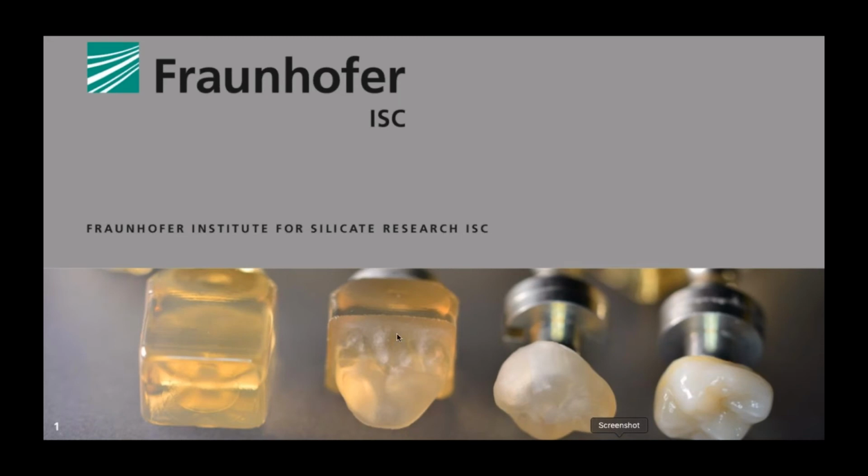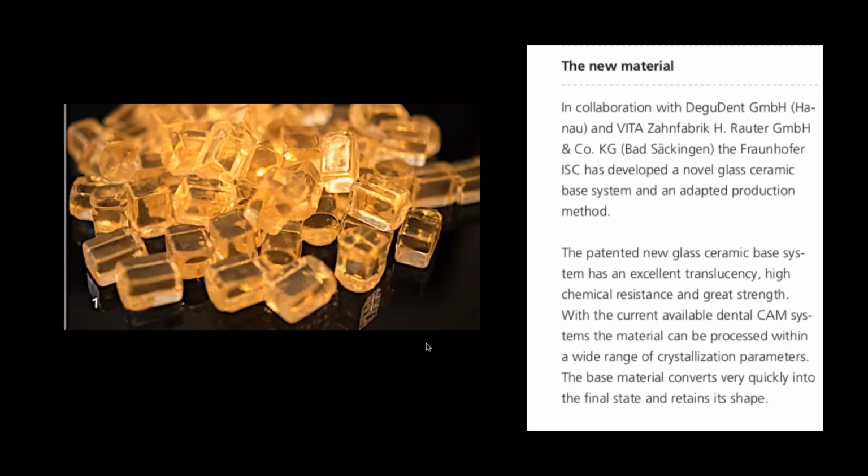So VITA and them came up with this neat material, which is partially crystallized. And then it's easier to mill. It doesn't take as much of a toll on your milling machine and your spindles and your burrs. And then you final crystallize them in the furnace.